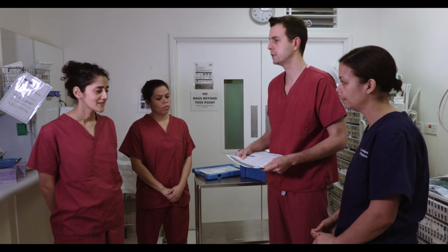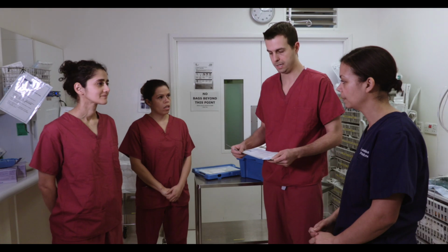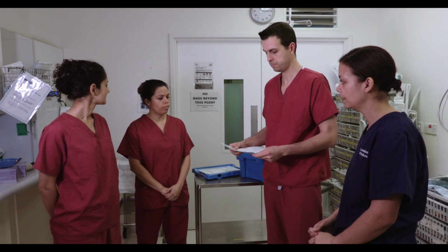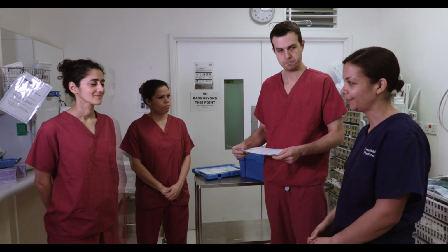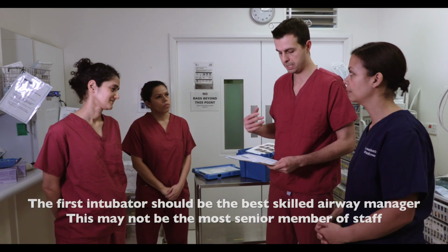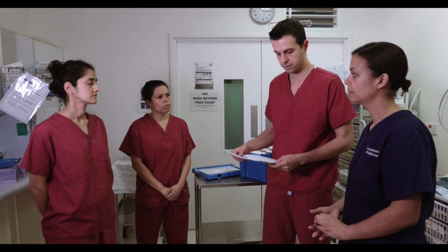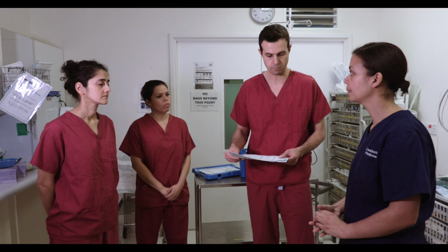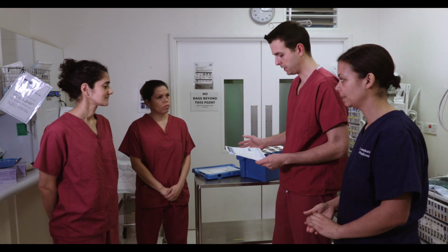1. Assemble team and allocate roles. Can we just all introduce ourselves? I'm Anita, I'm a consultant anaesthetist, I'm intubator number 1. Okay. I'm Carolina, runner. I'm Max, anaesthetic registrar. And I'm Ellie, ODP. Are you going to be first intubator? I am, yeah. Okay. I'm going to be team leader, I'm going to give drugs, and I'm going to be second intubator. And you're going to be our skilled assistant in the room, and you're helping with the airway. Yes. You're going to be our runner.